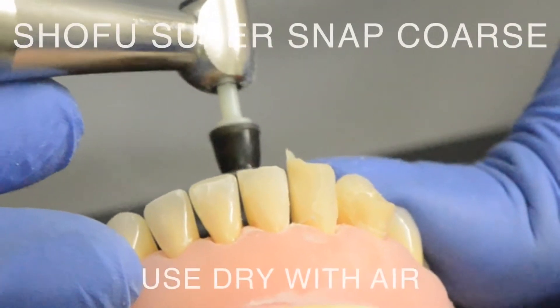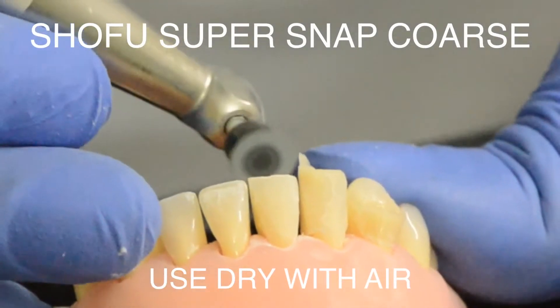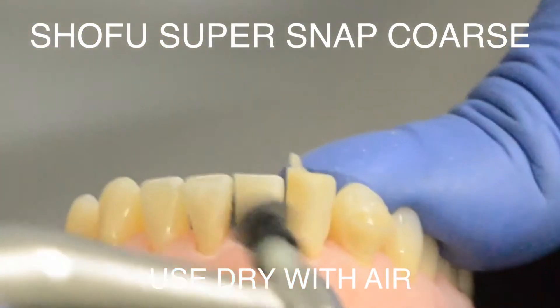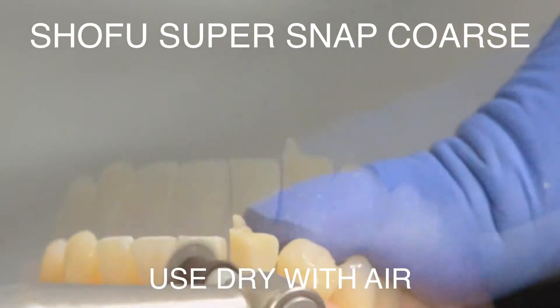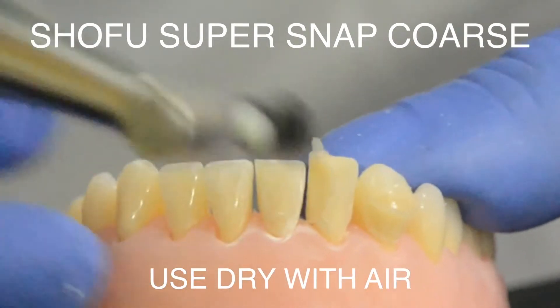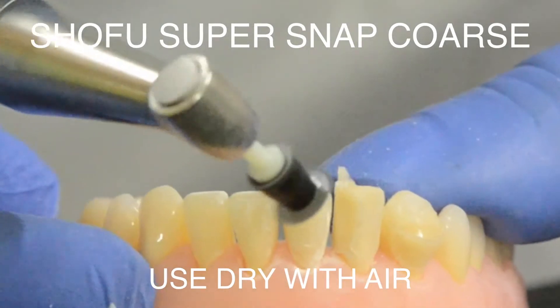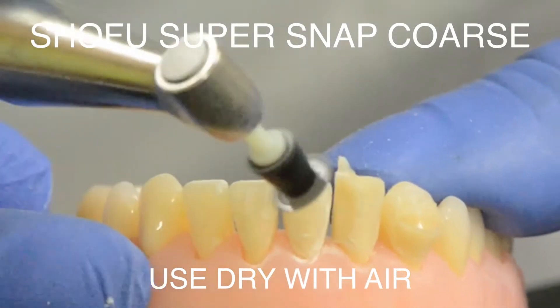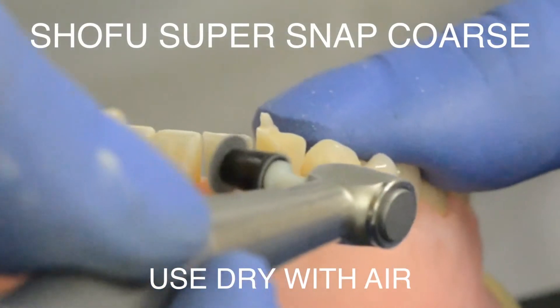The next step is to use a coarse diamond disc with an air rotor handpiece, and again no water — which means your assistant is going to have to direct some air with a three-way syringe as you remove the composite with the disc. In this video I've used the Shofu SuperSnap; these are color-coded discs and black stands for coarse.